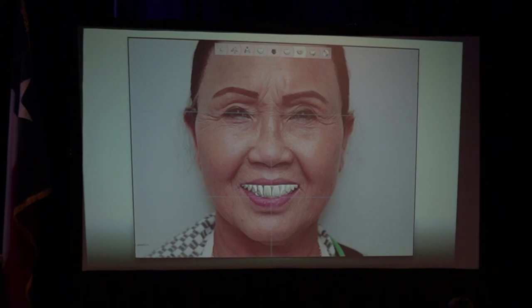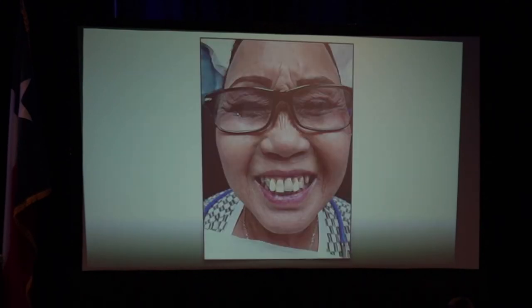But I think a lot of us haven't seen what it is, but it's very, very simple. You take the smile and you take the intraoral scan, it overlays, and you design it out. Otherwise, I'm going to have to be shaving down those teeth because they're super erupted to get the ideal smile line, and then you take that impression and send it all the way to the lab, but you're waiting.